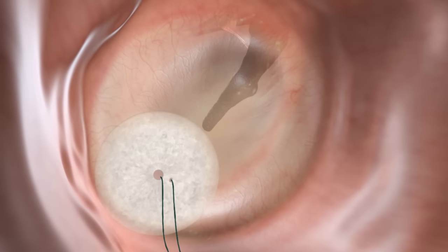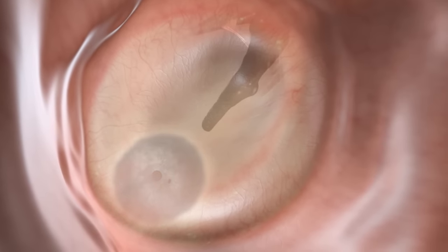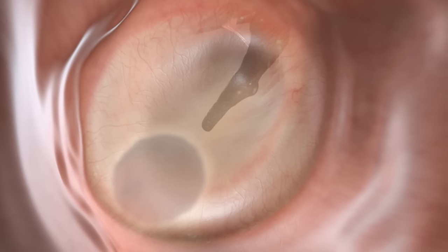During recovery, the biodegradable collagen grafts will function as a scaffold for epithelial cell growth and tissue regeneration, resulting in perforation closure.